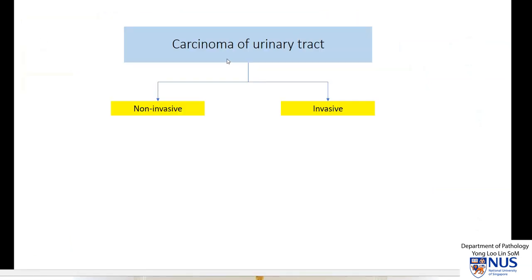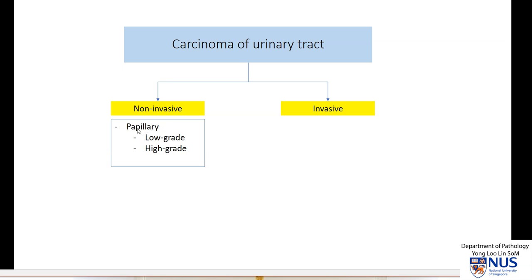Looking at urothelial carcinomas, there are two main types: non-invasive and invasive. Non-invasive usually have a papillary, frond-like architecture like what we are seeing here, and they can be low-grade or high-grade. You can also have a flat carcinoma in situ, where there is just a flat layer of malignant cells that have not invaded into the lamina propria.